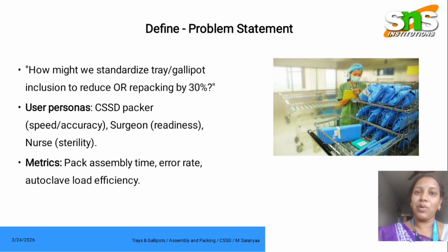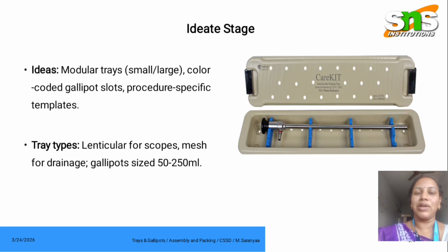They should have a proper knowledge of how to assemble the surgical instruments. And you have to be very cautious to deliver the instruments properly to the surgeons and nurses, and for proper sterility. The metrics have to be set here to properly analyze the condition: packing assembling time, error rate, and autoclaving load efficiency have to be monitored.